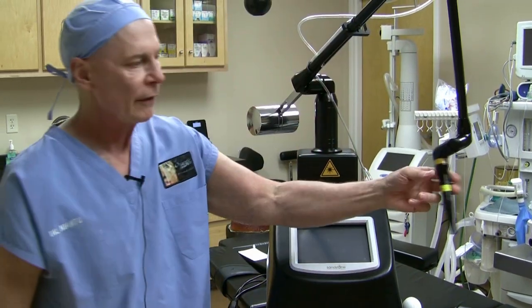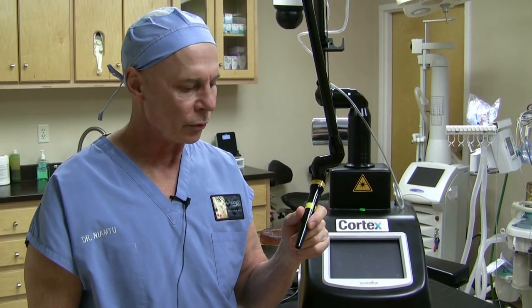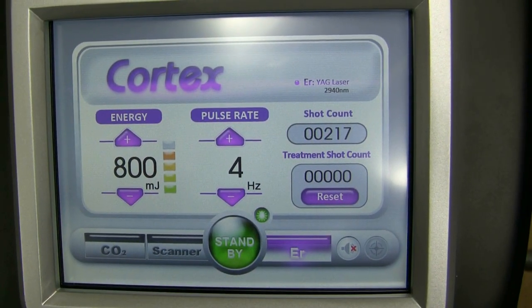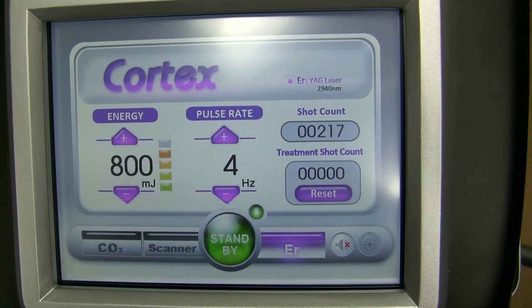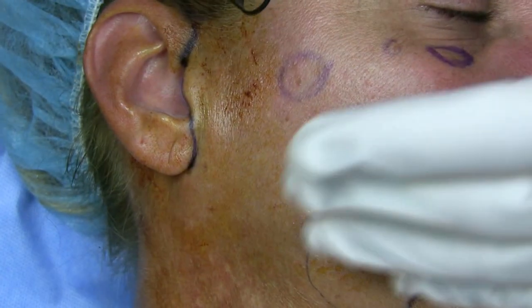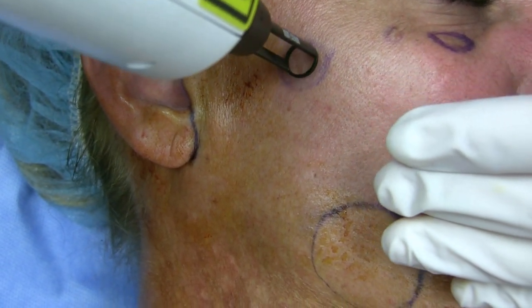And then also the incisional laser — this is what we use for blepharoplasty, mole removal, different types of ablations. We're going to be talking about the erbium or the 2940 nanometer laser which is part of the Elman Cortex sandstone platform, and this is really nice for brown spots or selected resurfacing applications. We're getting ready to do a facelift and some other cosmetic surgery, but she has some brown spots and we're going to treat them with the Elman laser.